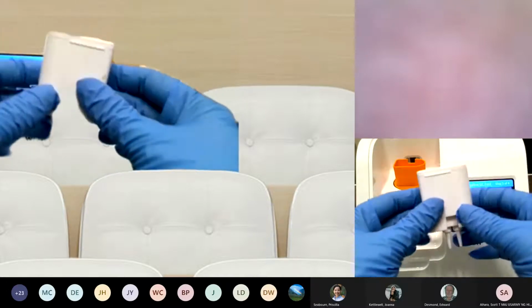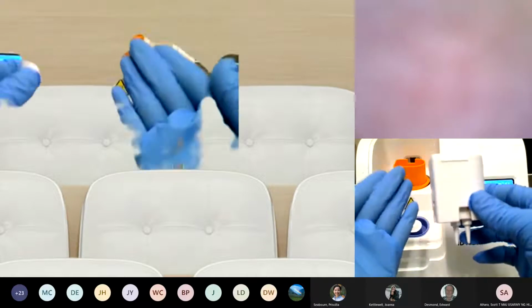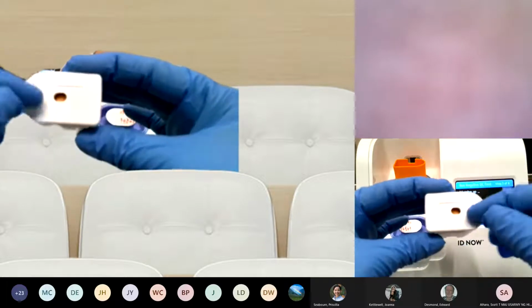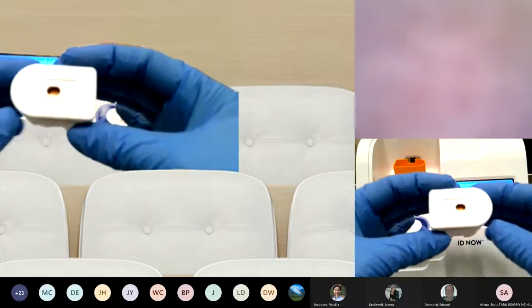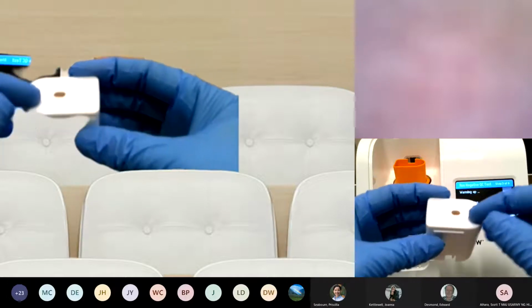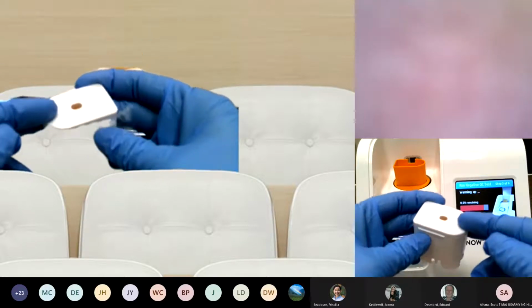One more thing is this final piece here. So here's that transfer cartridge. Remember that time I mentioned an orange indicator? If you look down below, all the way at the bottom of this hole at the top of the transfer cartridge, you'll see something orange. It's like an orange plastic piece, and that's the orange indicator. This indicator is crucial in making sure that you're running this test properly.